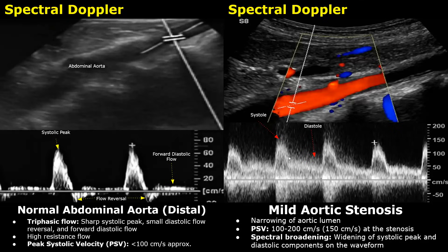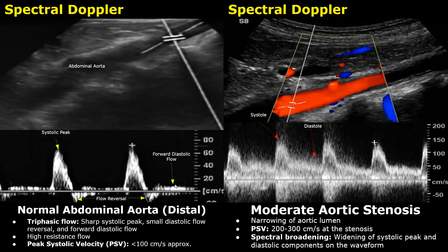This broadening and rough appearance of the waveform is called spectral broadening, and it is due to turbulent flow. There is some turbulence present because of the stenosis, which causes this spectral broadening. The turbulence is mild, so it is not prominent on color Doppler. The systolic peak appears wide and less sharp compared to the normal sharp and narrow systolic peak, and the diastolic component appears thicker than normal. If the PSV is between 200 and 300 cm per second, it is classified as moderate stenosis, and the turbulence will be prominent on color Doppler with greater spectral broadening.